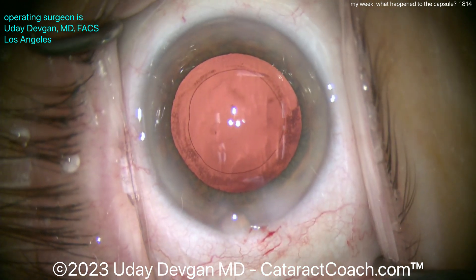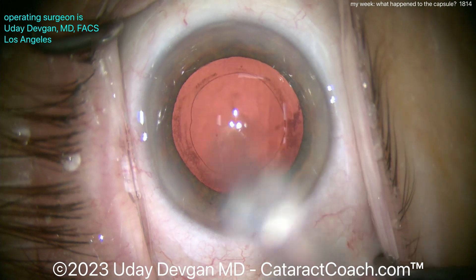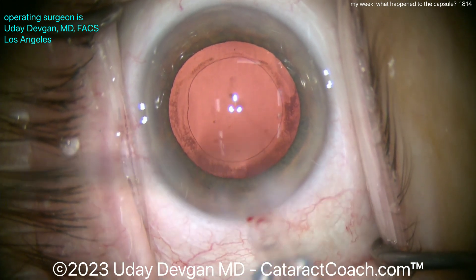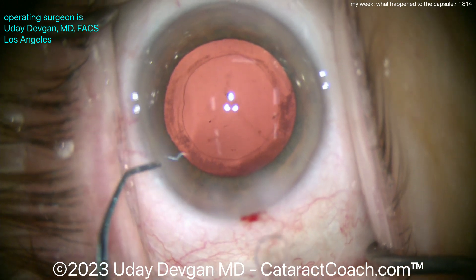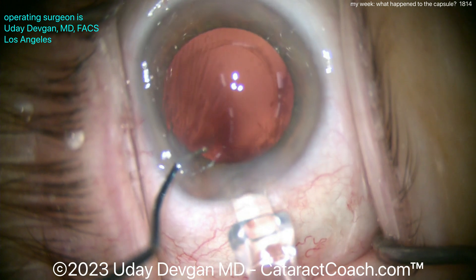We'll fill the capsular bag back up with our viscoelastic — cohesive — and let's get the lens in. We didn't break the capsular bag, but there's a lot of stress there. Remember, there's so much variation in patient anatomy, tissue strength, and tissue handling, so you have to be very cautious in these eyes.